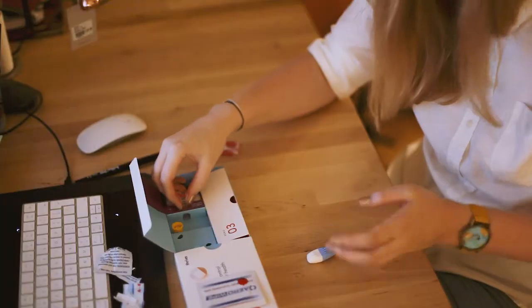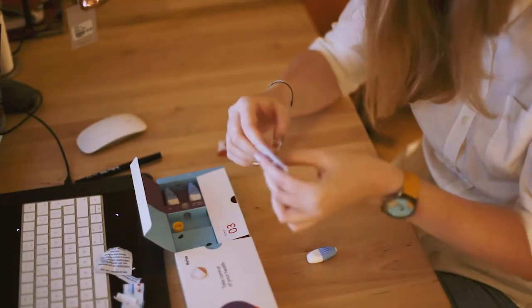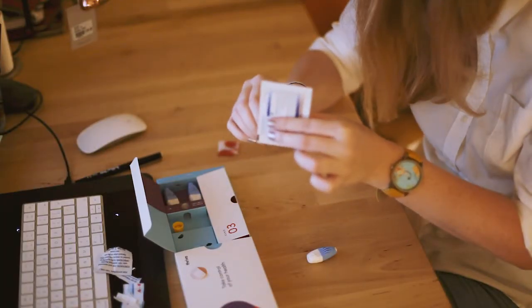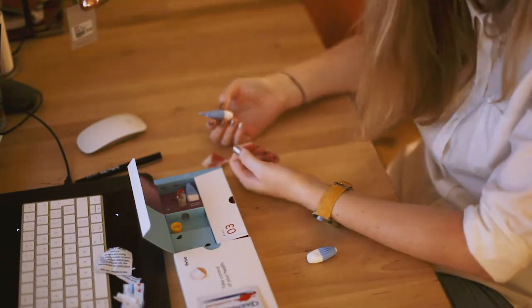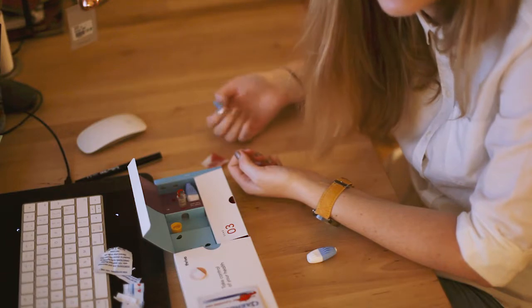There's blood everywhere else, there's blood on here. Maybe I can scoop some of that in — there's tons of blood on here. I'm gonna have to do another finger again and I don't want to.